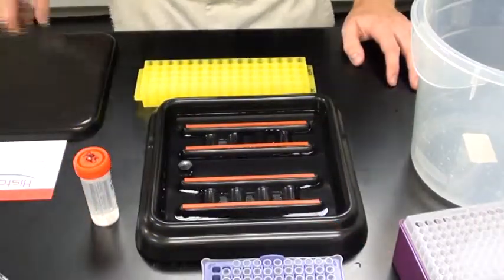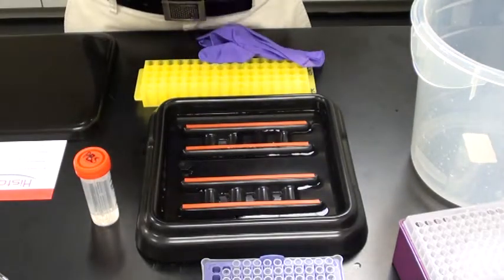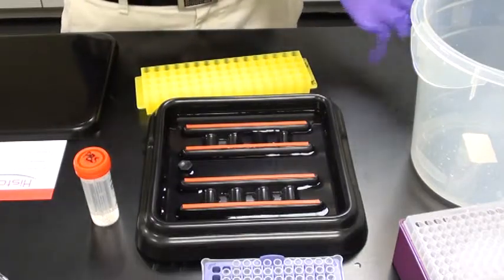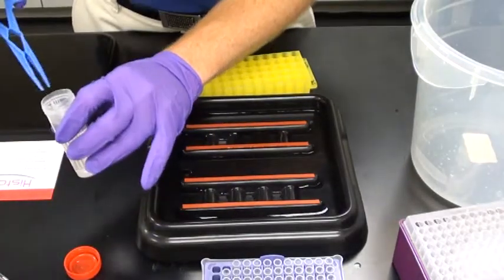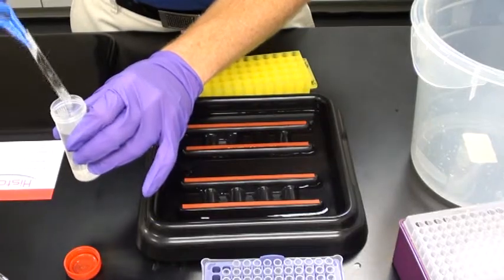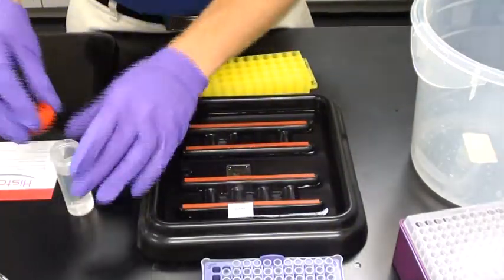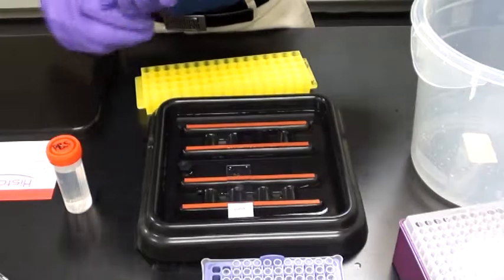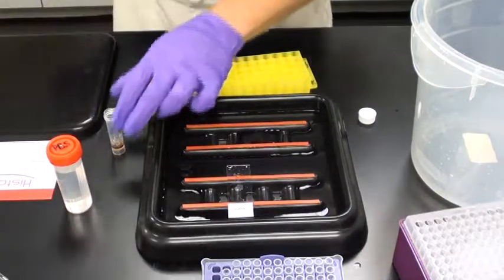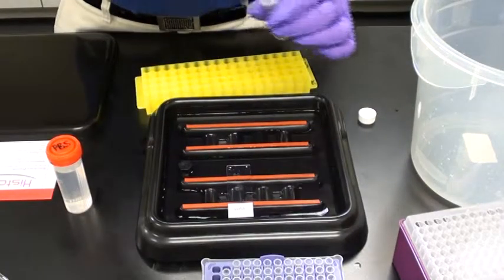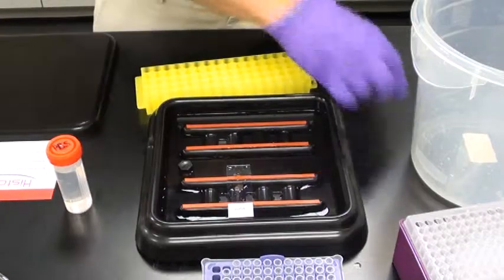After 2 minutes of agitation in the PBS 7.4, it's time to reveal our probe. We're simply going to remove the slide from the slide jar, put it back into our tray and apply DAB just like an IHC. We're going to put on just enough DAB to cover the tissue section and let it sit for 5 minutes or so, depending on how old the DAB is.